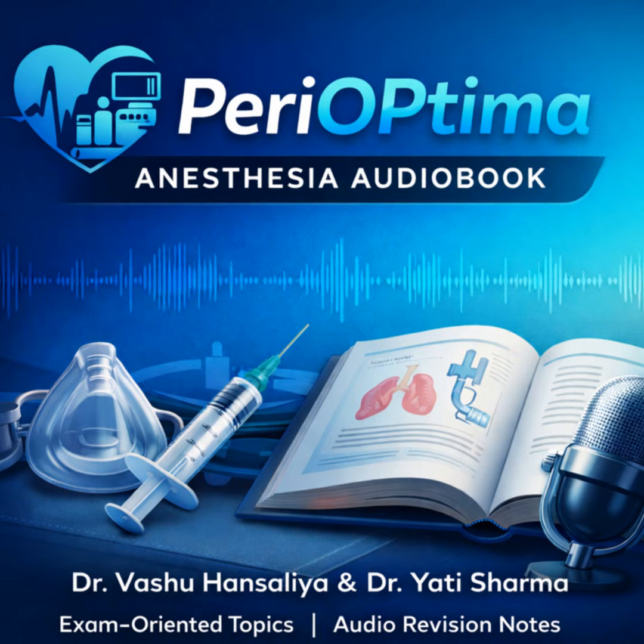But let's bring it back to the exam perspective. What are the key connections our listeners need to master? Okay, so you can't talk about laryngoscopy without talking about anatomy. It's just impossible. So be ready for Viva questions on the larynx itself, its innervation, especially the superior and recurrent laryngeal nerves, and the clinical signs of vocal cord palsies. But the absolute centerpiece, the thing you have to know inside and out? The modified Cormack-Lehane grading system. You have to understand it, not just memorize the grades. It's the universal language we use to communicate how difficult an airway is.